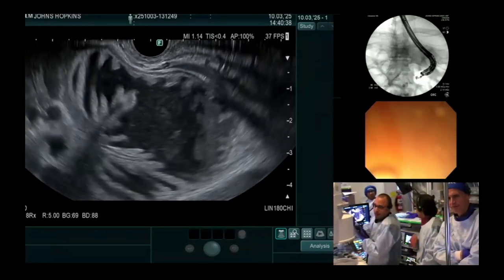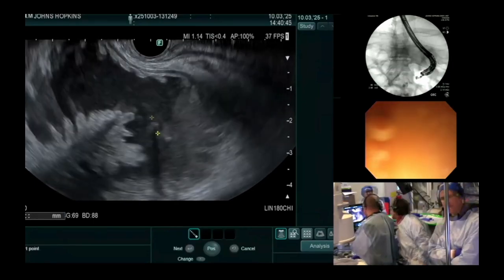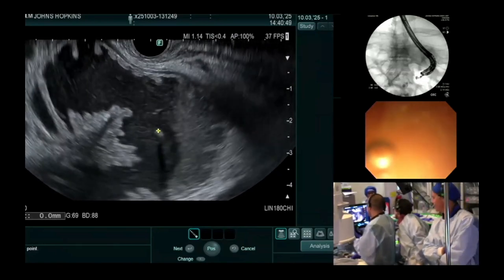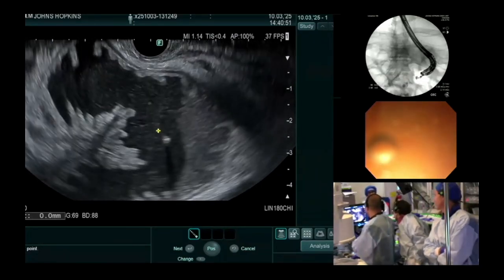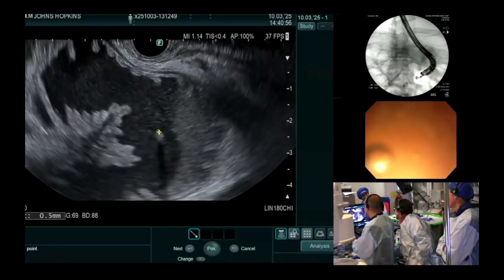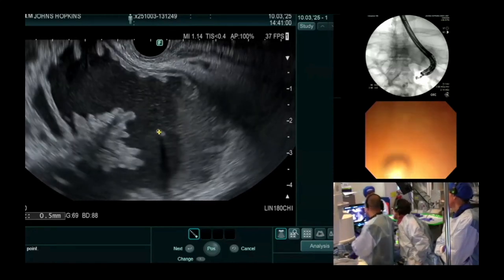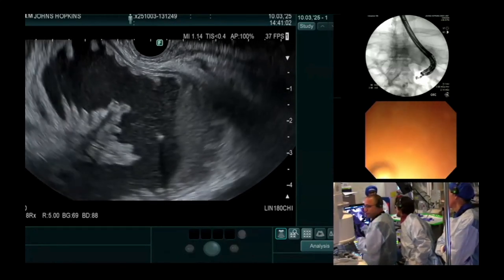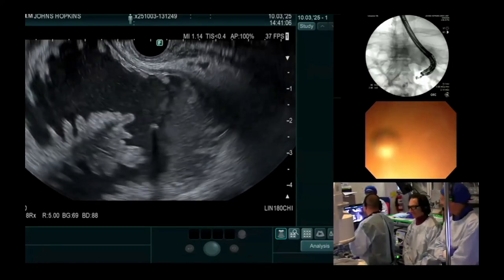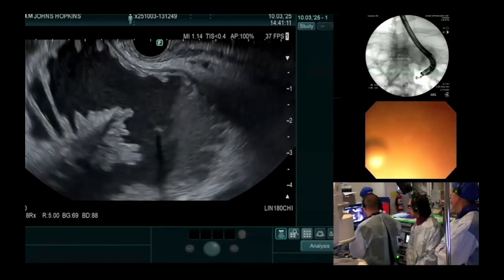You see fluoroscopy here, but we're not going to need it because we know for sure this is the afferent loop, because Ken here is showing you the pancreatic stent. Patient has a surgical pancreatic stent in place, and you see it here. And also we followed the loop towards the hepatojejunostomy. So we don't need to inject. We know this is the afferent loop.